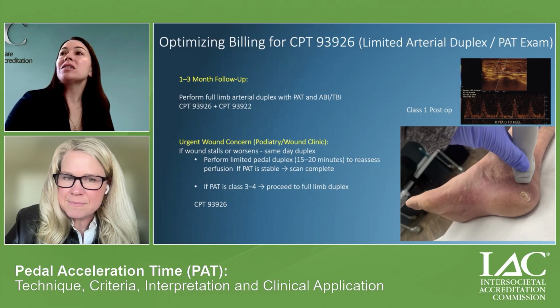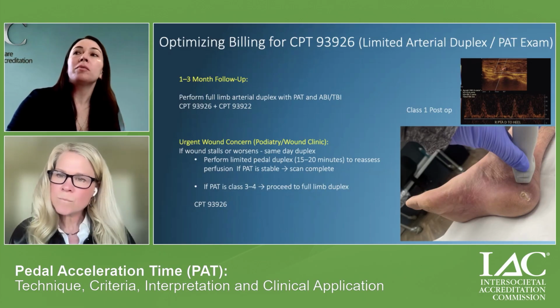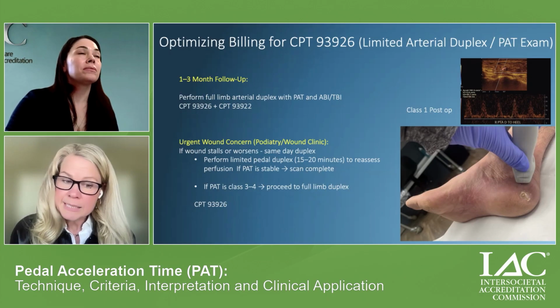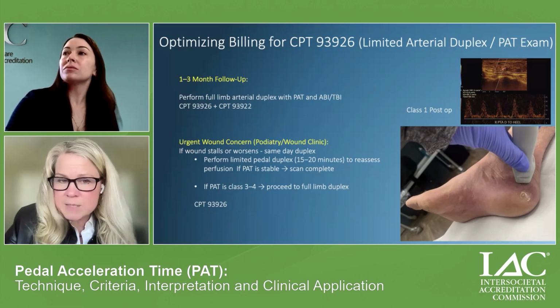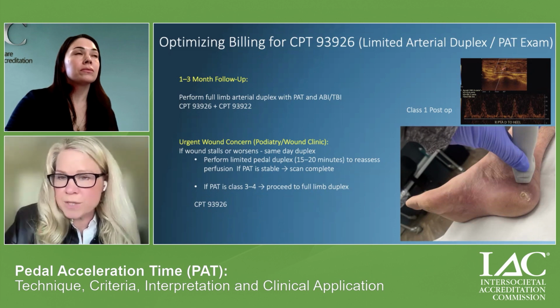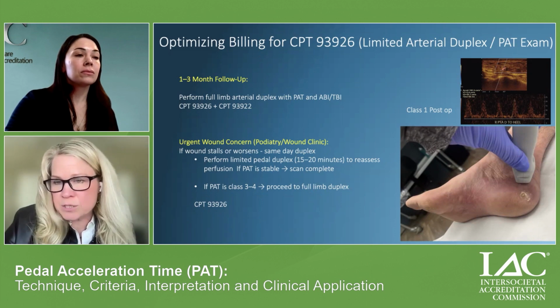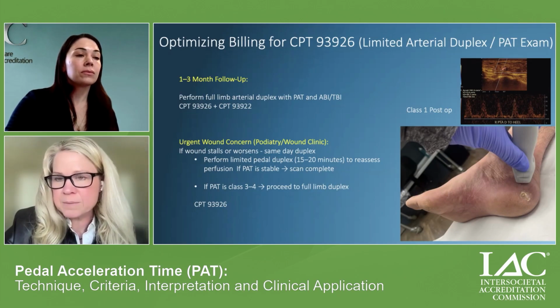How does PAT compare to absolute toe pressure in terms of wound healing potential? Yeah. So we did that really nice paper on the diagnostic accuracy, and it's comparable to toe pressure. So we can use the absolute toe pressure in comparison to PAT, and they're almost spot on. So take a look at that paper.